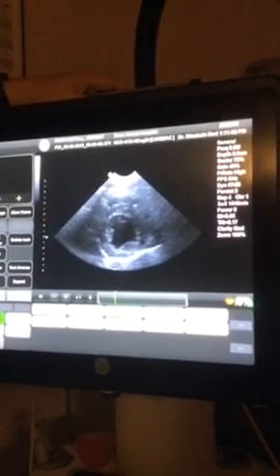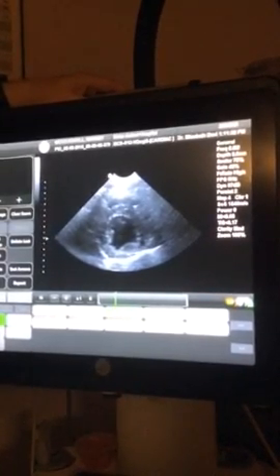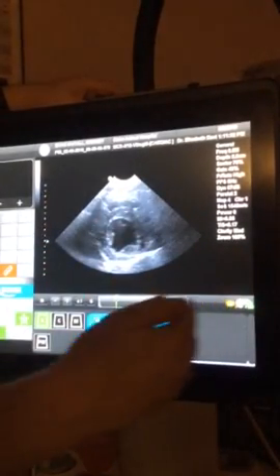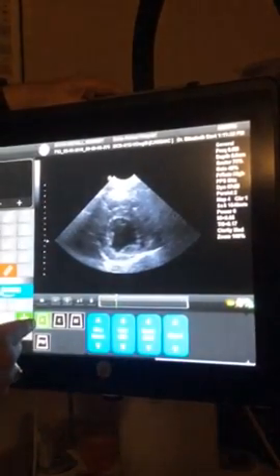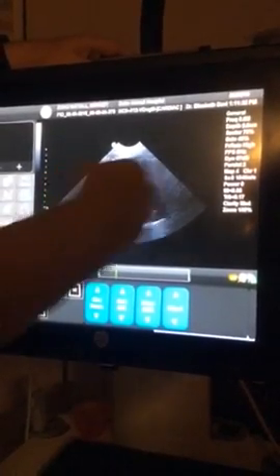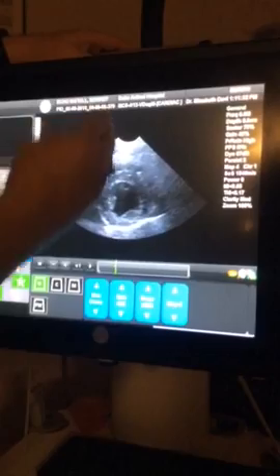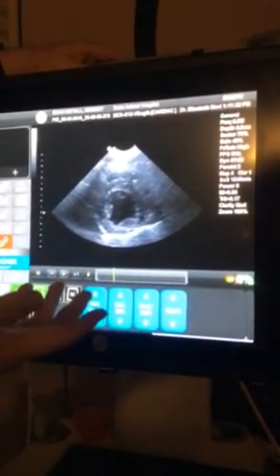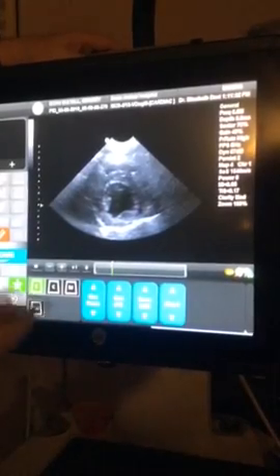So now after you've done all three, then what do you do? After all three, you just close that. And now we're going to go ahead and learn M mode as well going through this. But like you first mentioned, it's one or the other. If you do all of them together, it's fine. If you do anatomicals, motion mode, and LAAO, you didn't do anything wrong. You just took an extra step when maybe you didn't need to.